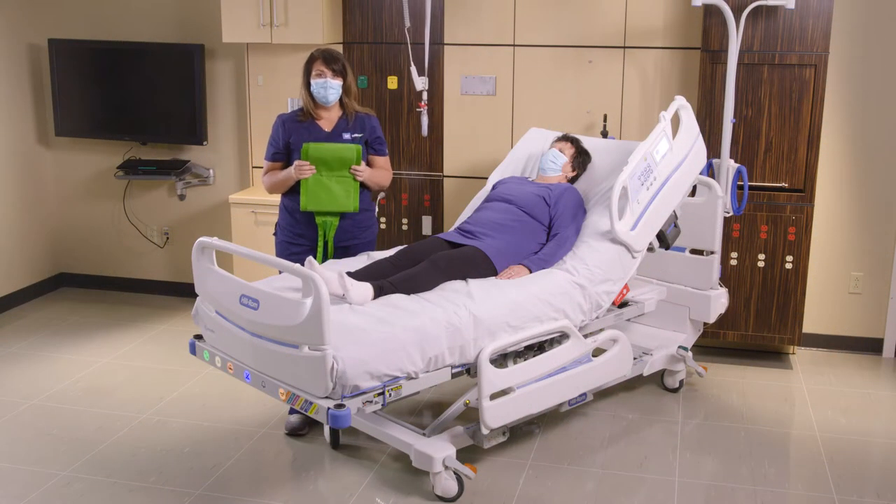I'm going to show you how to use the Hill-Rom Multi-Strap. The Multi-Strap can be used for a variety of activities including proning, wound care, and limb holding. Today I'm going to show you limb holding.